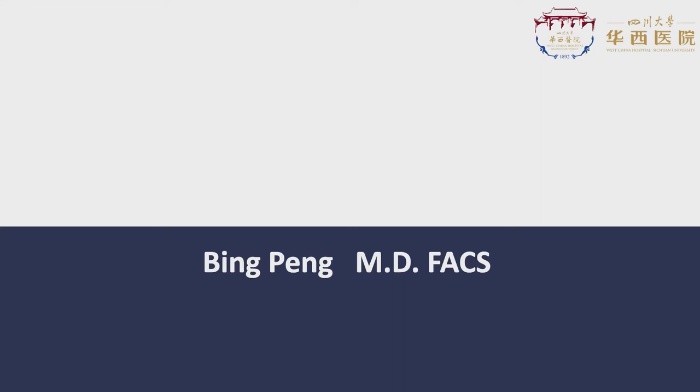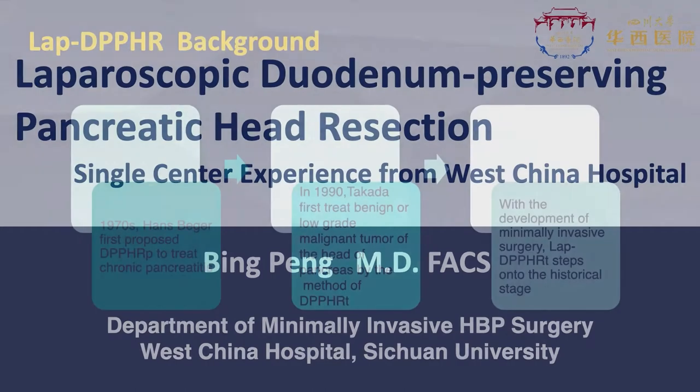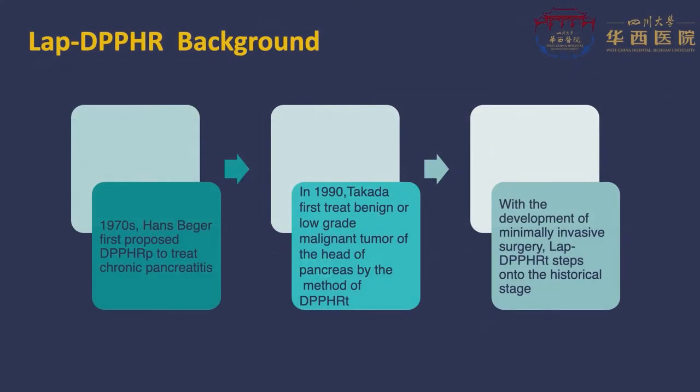It's my great honor to be here to present. Our topic is laparoscopic duodenum-preserving pancreatic head resection, a single center experience from West China Hospital. First, let's start with some background. In the 1970s, Hans Beger first proposed DPPHR to treat chronic pancreatitis.